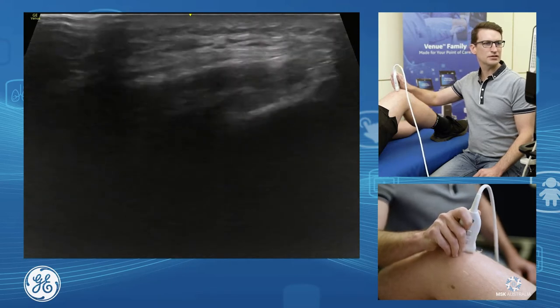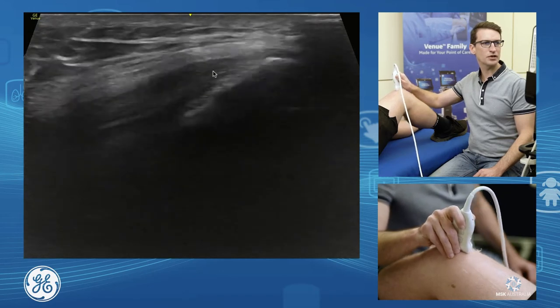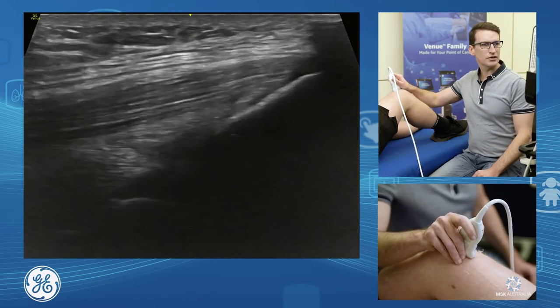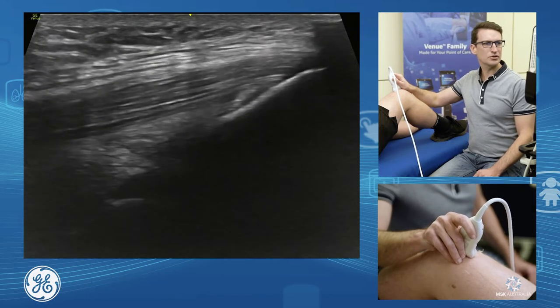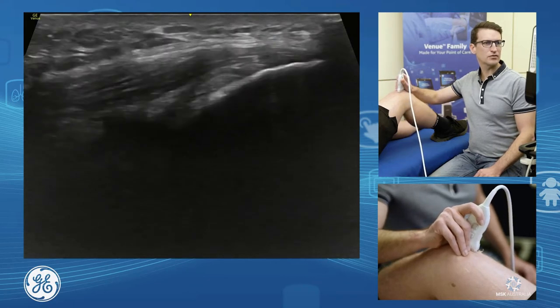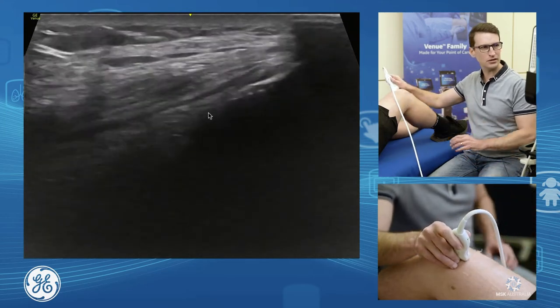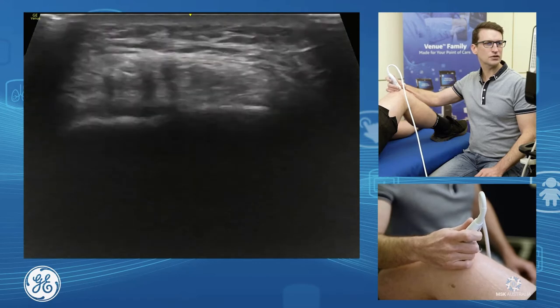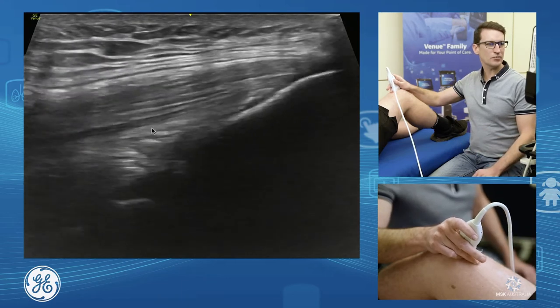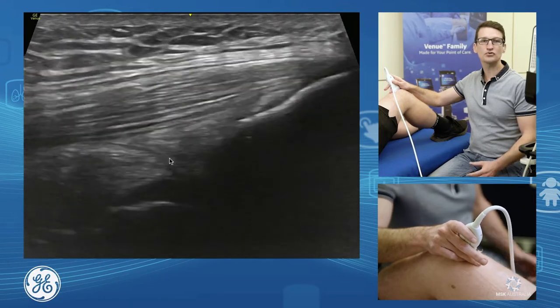Our patella is a sesamoid bone, and we'll see some of those fibers of our rectus femoris continuing up and over the patella to continue on as our patellar tendon or infra-patellar tendon. The quadriceps tendon is not an uncommon area to have tendinosis. It's quite a broad attachment, so we want to assess all the way out laterally and medially in both transverse and longitudinal. Just below is our quadriceps fat pad and pre-femoral fat pad sitting deep, and we can see a little bit of joint fluid in our suprapatellar pouch.